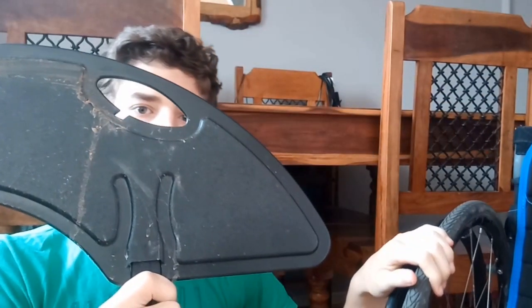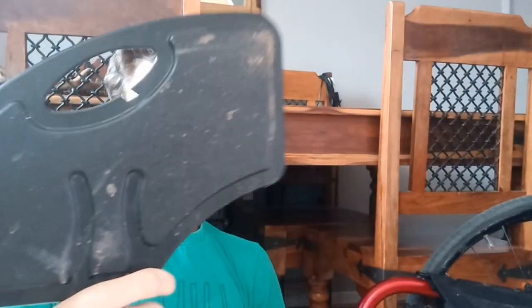The first thing I'm going to do is just dismantle it as much as you can without using any tools, okay? So, first things first is the cushion that has been velcroed on. So cushion, now this has got a bunch of hairs on it, a bit of mud from when I've taken it off and sat on it. And then, as you can see, there's just a bunch of shit in the seat as well. So, next off is these side guards, which get very muddy, because that is their job. I don't think I really need to explain them.